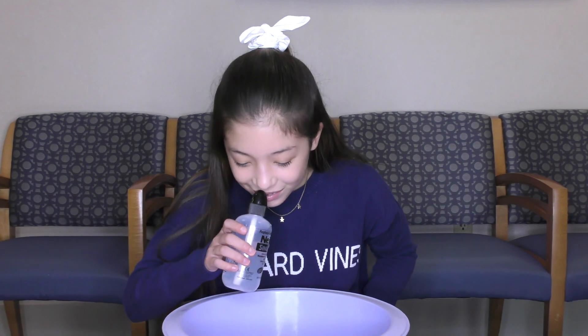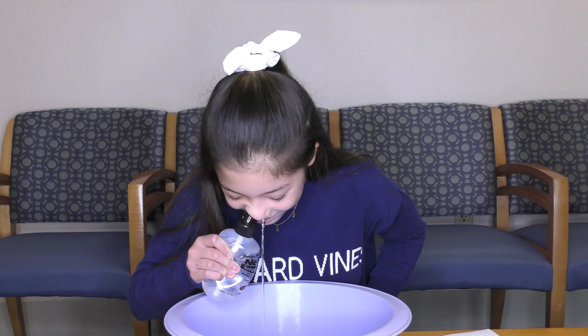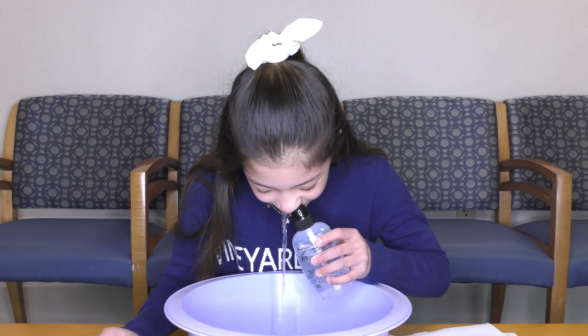Standing over the sink or basin, lean forward and tilt your head slightly down. Keeping your mouth open and without holding your breath, place the cap snugly against your nose.